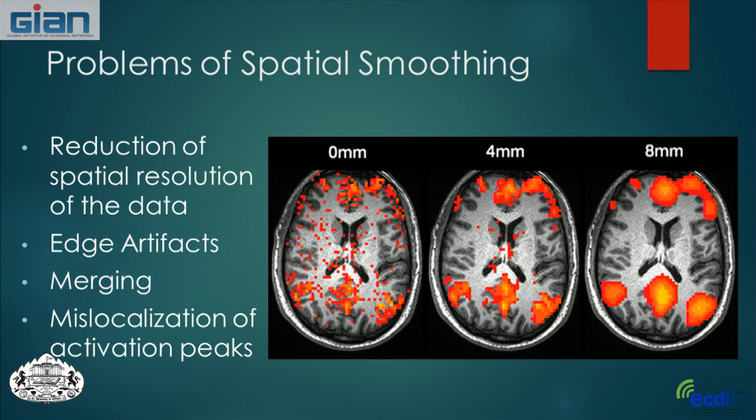And that might not be the best thing, as we're going to look at later when we look at data analysis, that sometimes these little spots of activation are just false positive areas, like regions of activation. So smoothing helps to get rid of those little tiny pinpoint spots. And at 4 millimeters smooth in the middle, you see that's not a bad compromise. This on the right here is 8 millimeters spatially smooth. And that really makes a very nice picture.